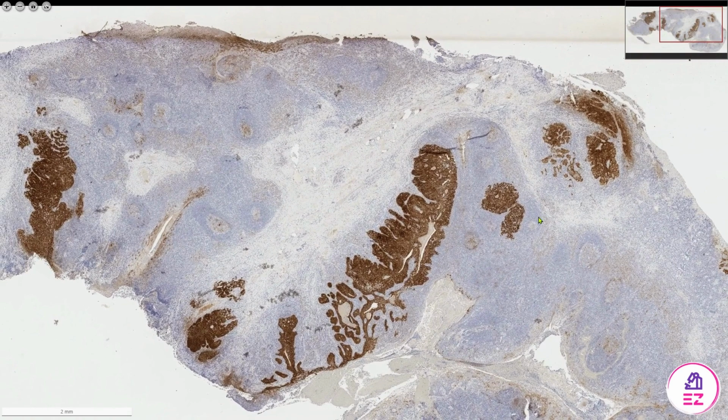We would also do an HPV in situ hybridization, or PCR, to confirm the presence of high-risk HPV, and it's usually HPV subtypes 16 and 18. So this was an example of an HPV-associated squamous cell carcinoma.